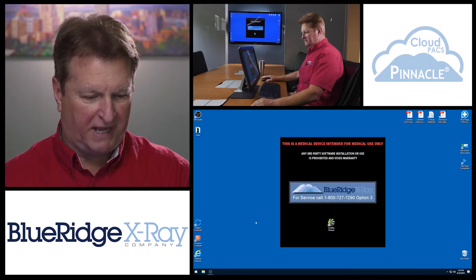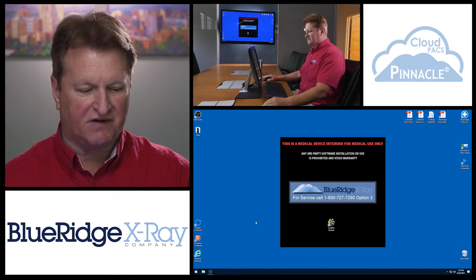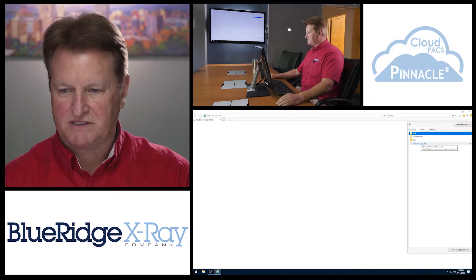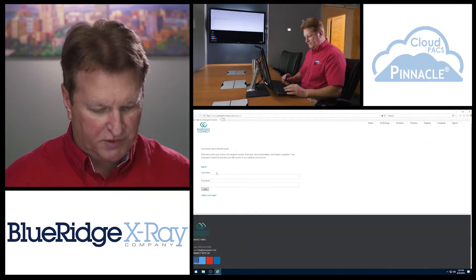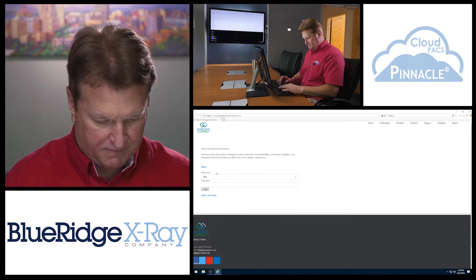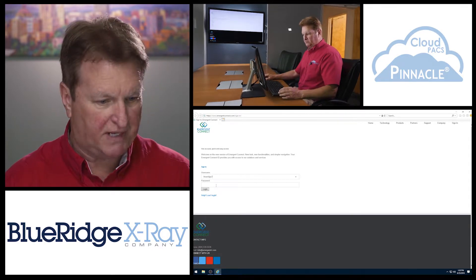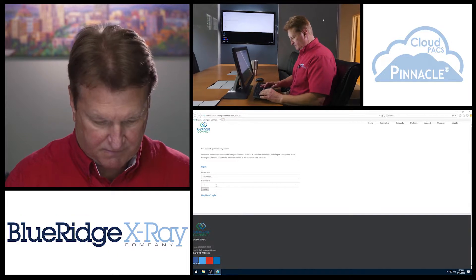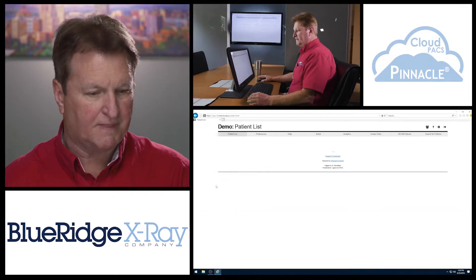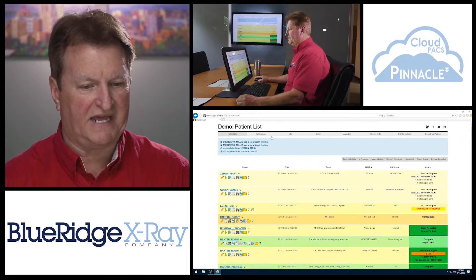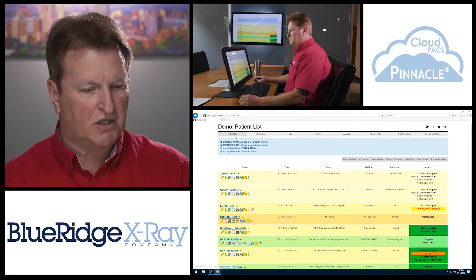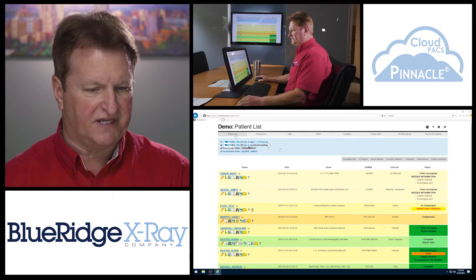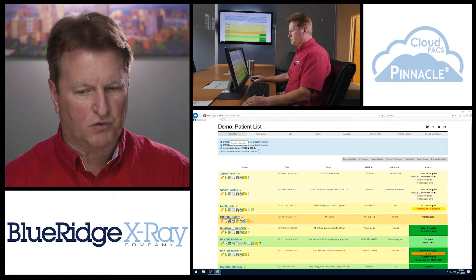To launch the Pinnacle Packs from any browser and any device connected to the internet, I save it in my favorites. You simply put in your unique username and your password — these are configurable by the admin at setup. It launches to the patient list screen and to an information bar at the very top that gives significant information such as significant findings, incomplete orders, etc.